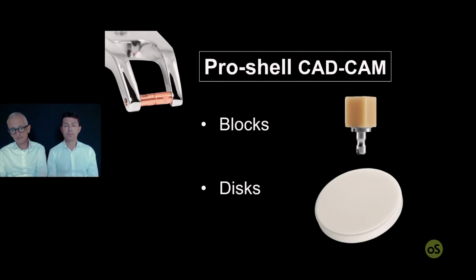Yes. But at the end, what I see is a limit, at least from my knowledge, which may not be correct, as these things are constantly improved and updated. Of these 3D printing bridges, the durability of the material at the moment is not comparable to, for example, the hybrid ceramic blocks that we are using, right?